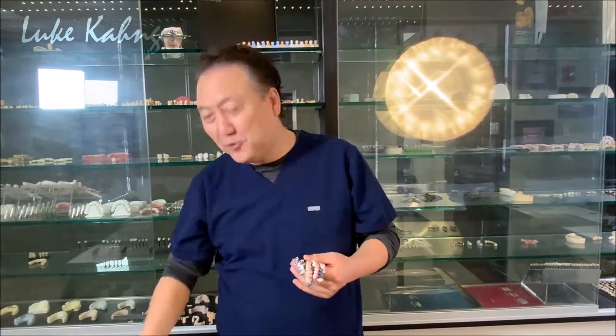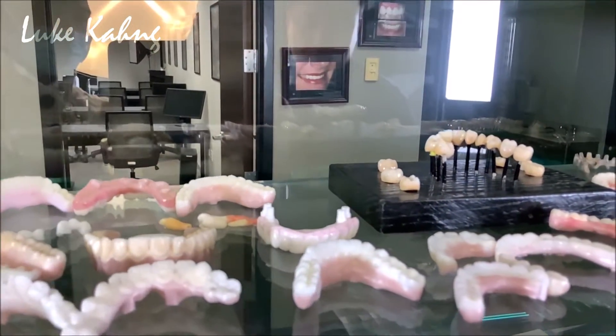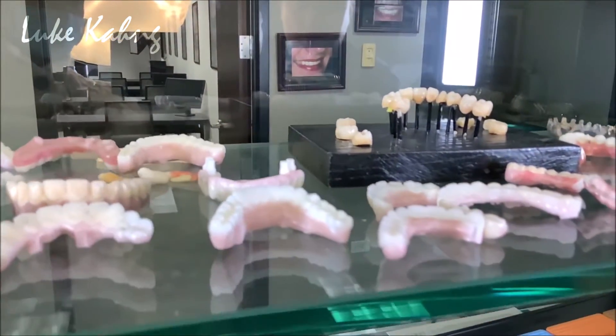Two and a half years ago, we also made a video on the $5,000 full-mouth zirconia. As you can see, there are so many zirconia cases with failures, and I want to address those issues.